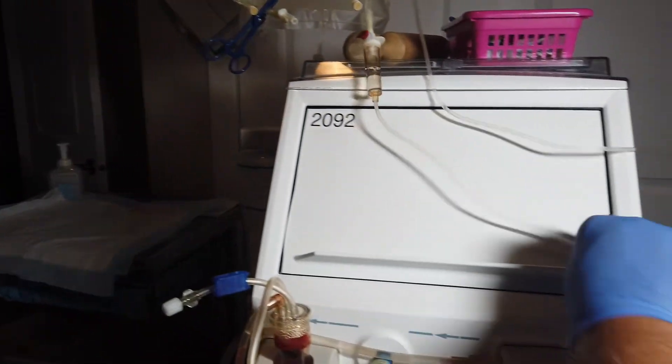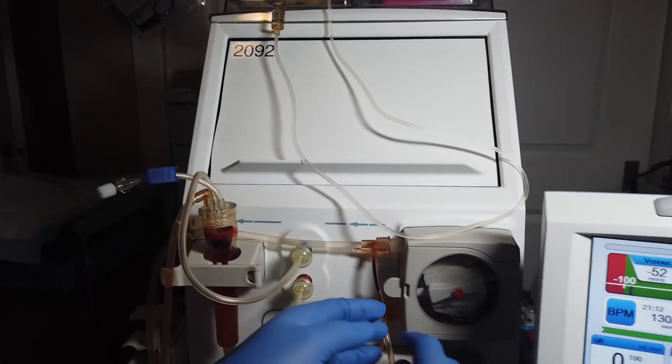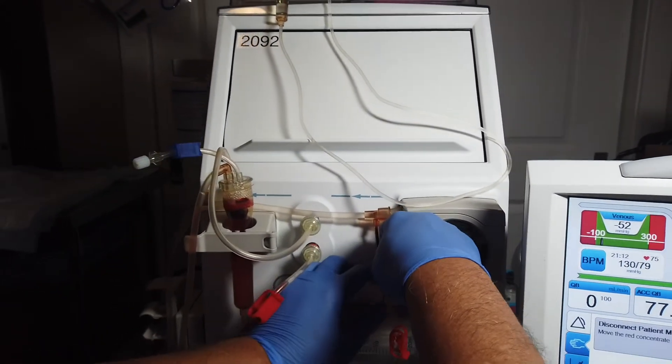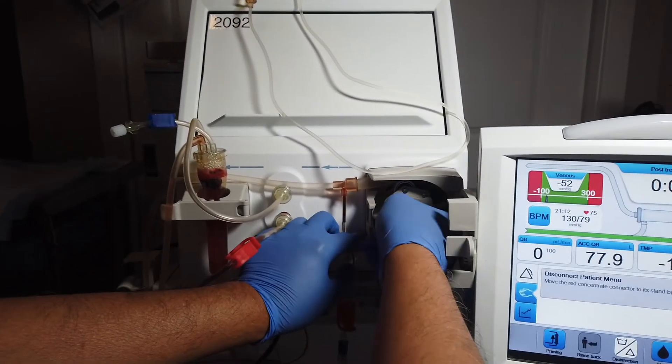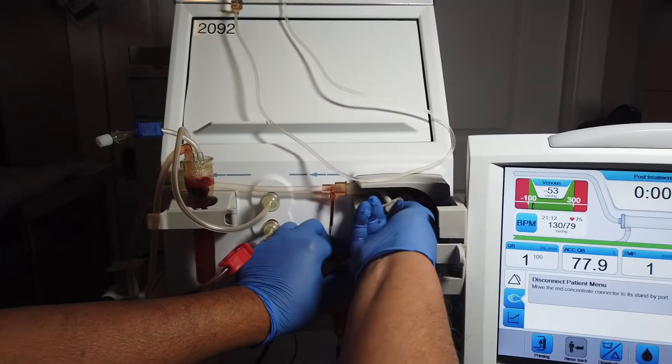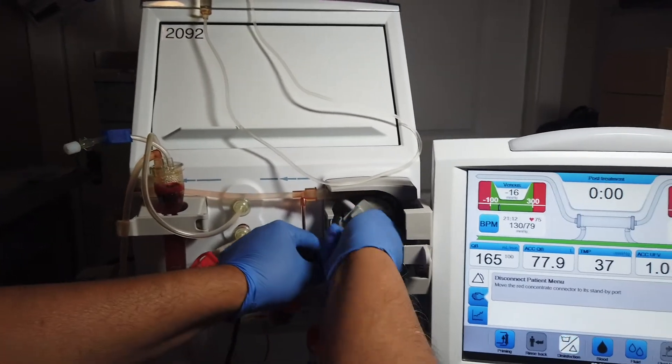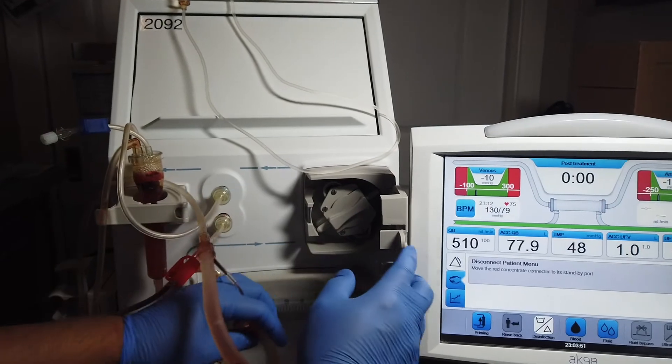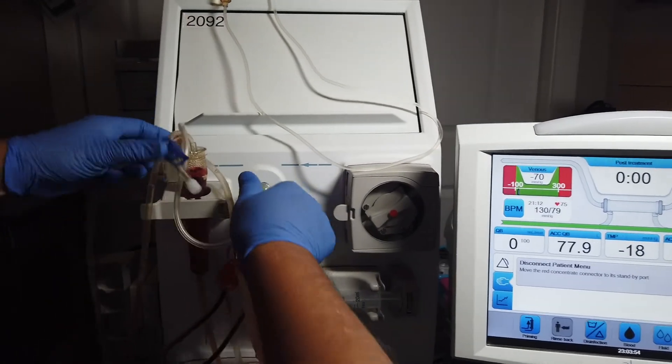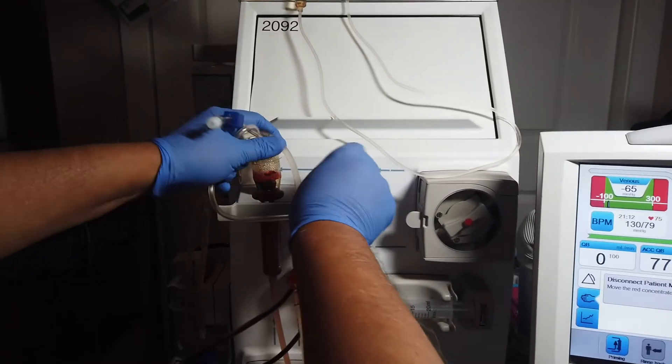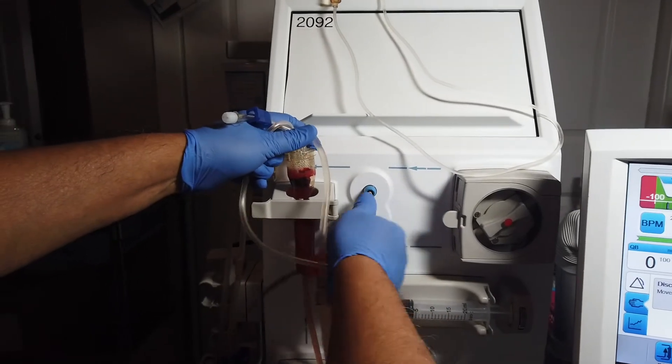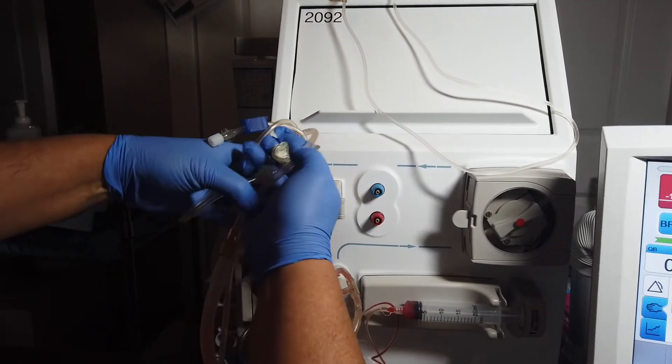After that, I go ahead and take off the line itself. I always like to start with the pump area because I don't want the pump to get caught. Release all the hatches. Unscrew the venous tube and also the arterial sensor tube.